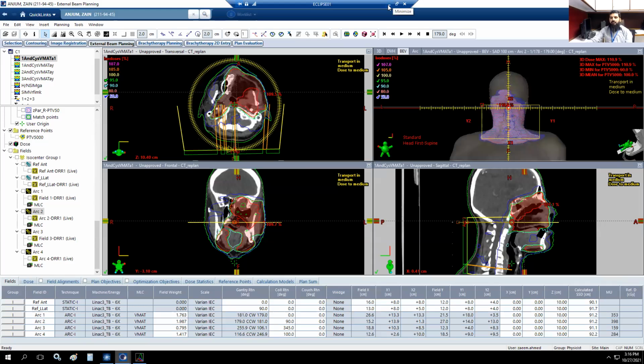Sorry to say. If the PTV and the OARs are merged in each other, you can't have both limited organs and full PTV coverage at the same time. So I don't think it is possible. Then you have to create the VMAT PTV structure by subtracting the OAR and optimize on it.